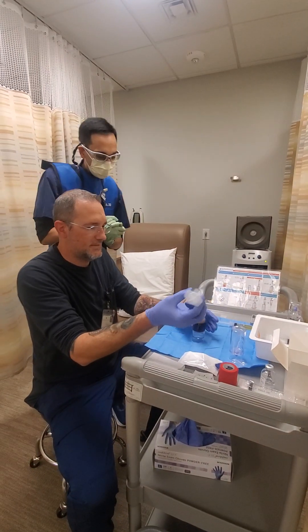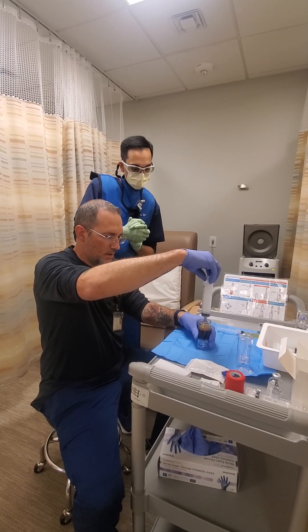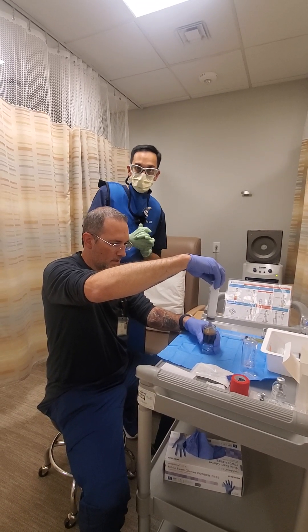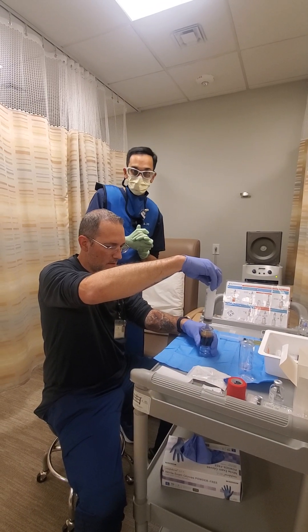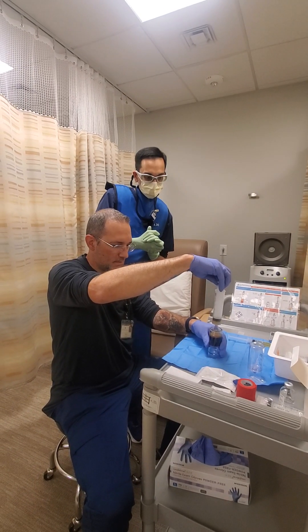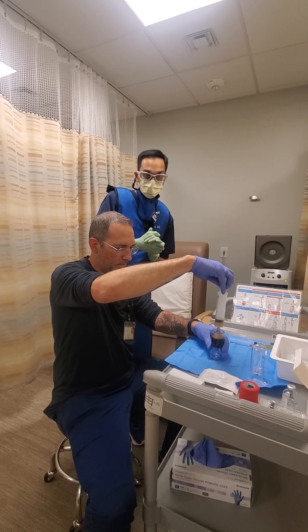Hey guys, Dave is our Superman here getting what we call the liquid gold for our next procedure. We're going to be injecting this for chronic back pain. The super shot helps to absorb or pull out some of the really special things that we used to throw out from the sample. So now this really hypercharges the PRP, stimulates healing in the tissue. David is our resident vampire — does a great job with the blood draws, almost painless. Once he gets us prepared we'll get ready to go. We'll be putting this in one of my patients under imaging today and hoping to help start her healing journey.